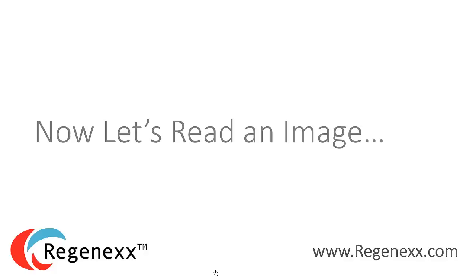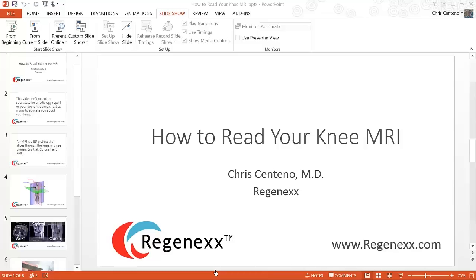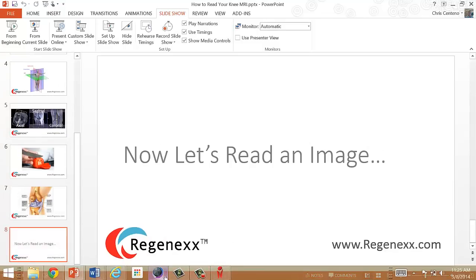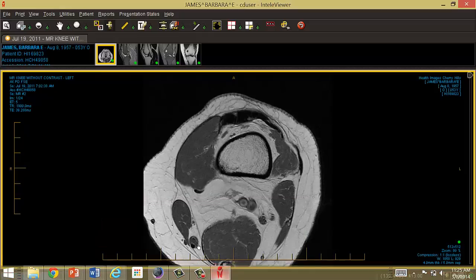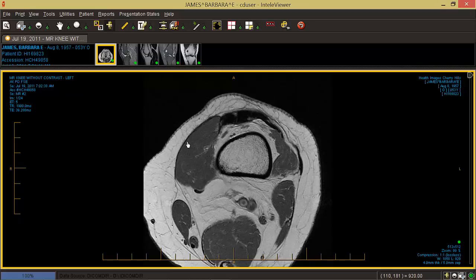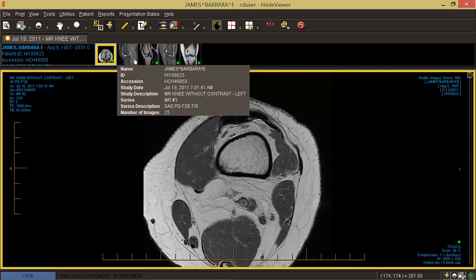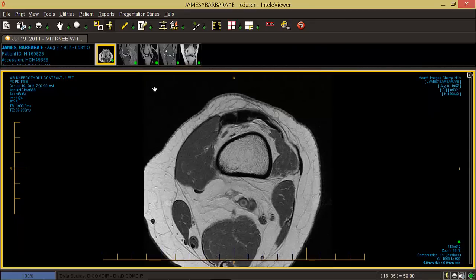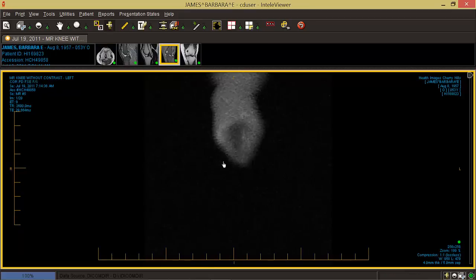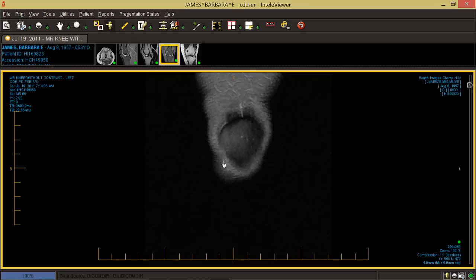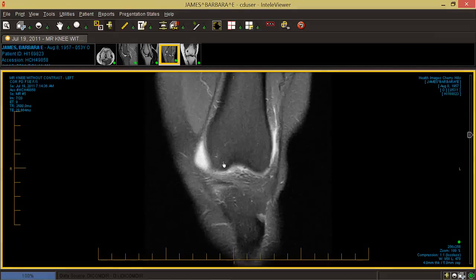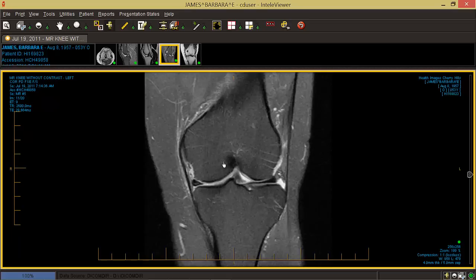Now let's read an image. This is a patient who allowed her image to be used for this, so I want to give her credit. Here I'm in the MRI program. Up here you can see different types of images — we have an axial image, a side image, and some front images. Let's start with one of the coronal or front images. It starts from the front, and I'm going to quickly march through to about the middle of this image.